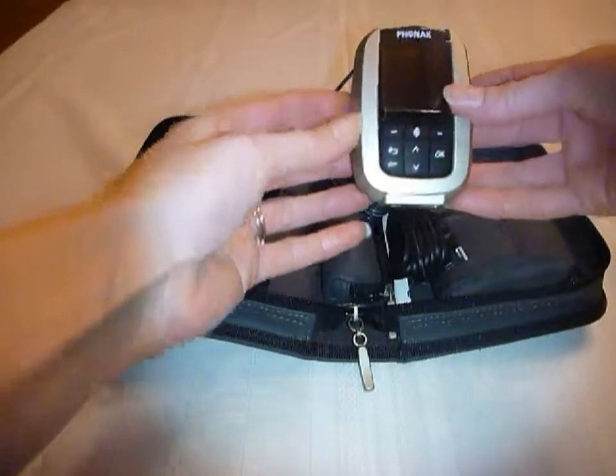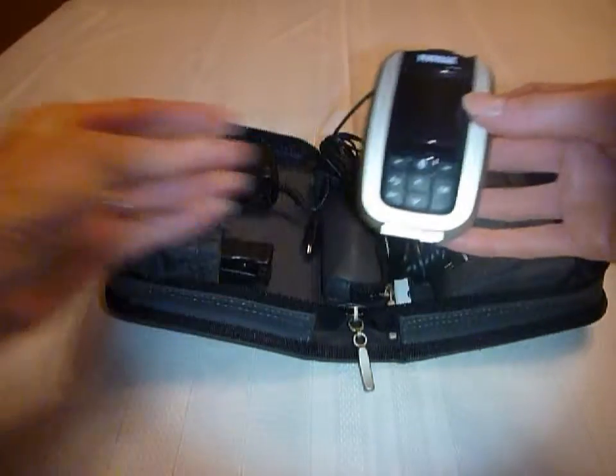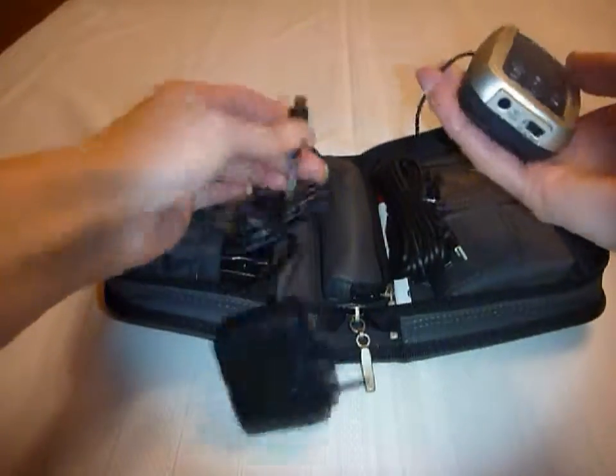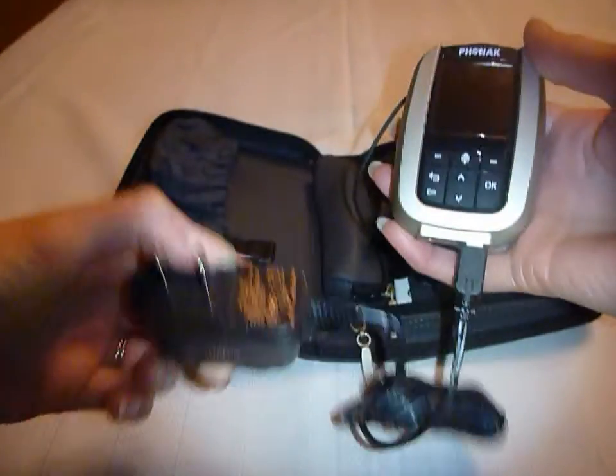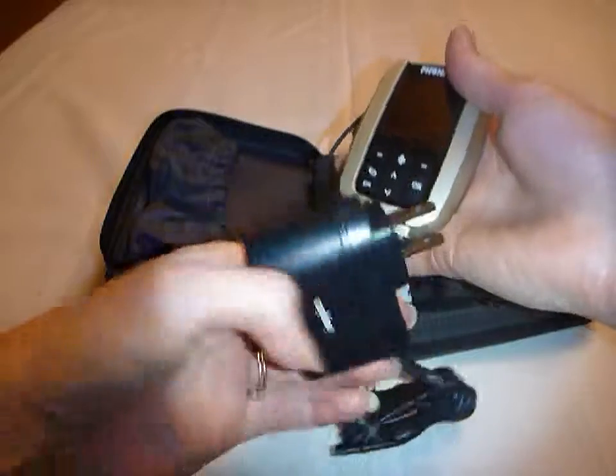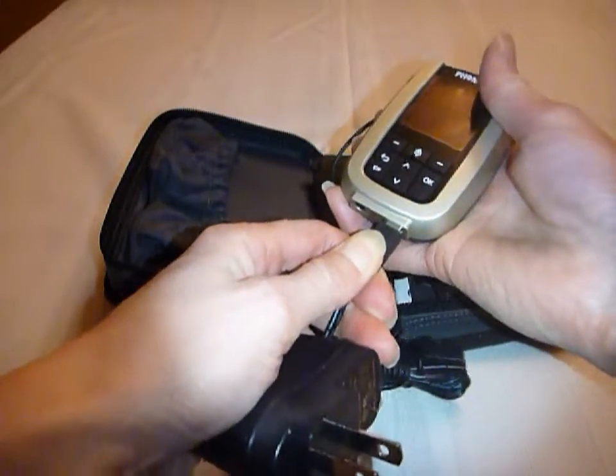When you receive your Inspiro kit, it's important to look in the package to see all the components. There's a power supply, which fits into the bottom of the transmitter, and you just plug it in. It takes about two hours to fully charge; however, after one hour it'll be about 80% charged.